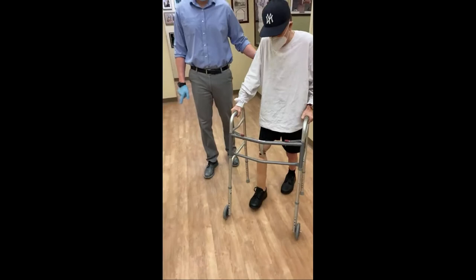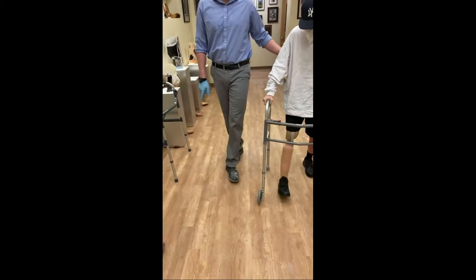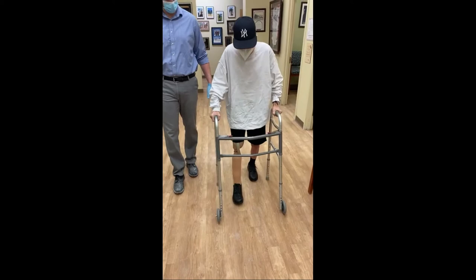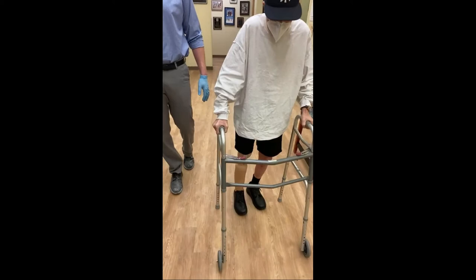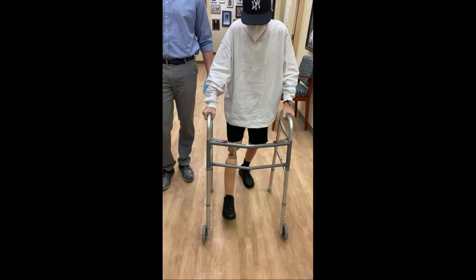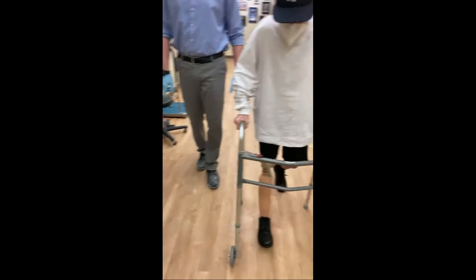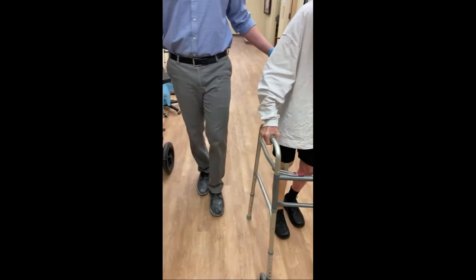Let's make a right-hand turn and walk towards those steps. Shorter step, shorter step, shorter step. Are there steps going into your house in Arizona? No. Walker, step, step. You really want to take shorter steps, especially on the prosthesis. Here are the stairs. Now, how do I do that? We're going to get up to them, hold on to the handrail, and then I'll explain.